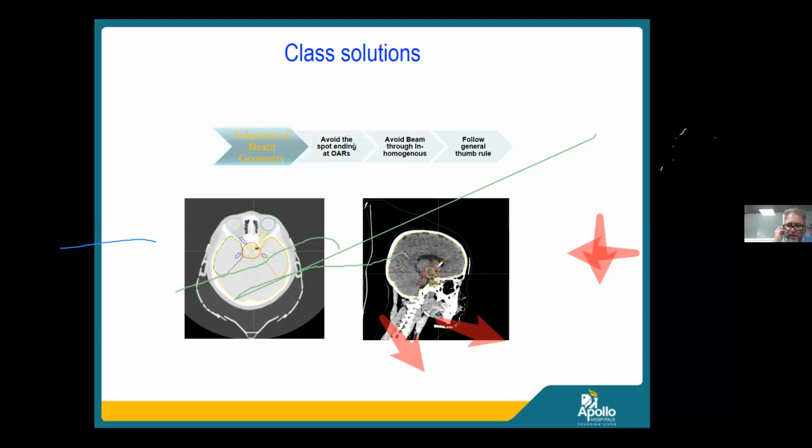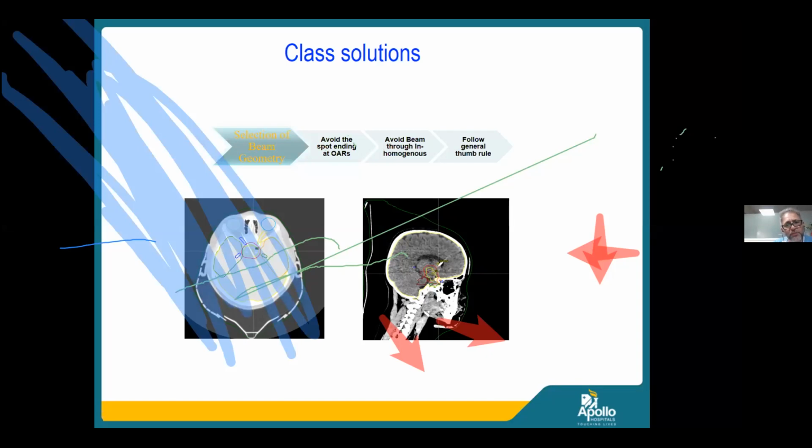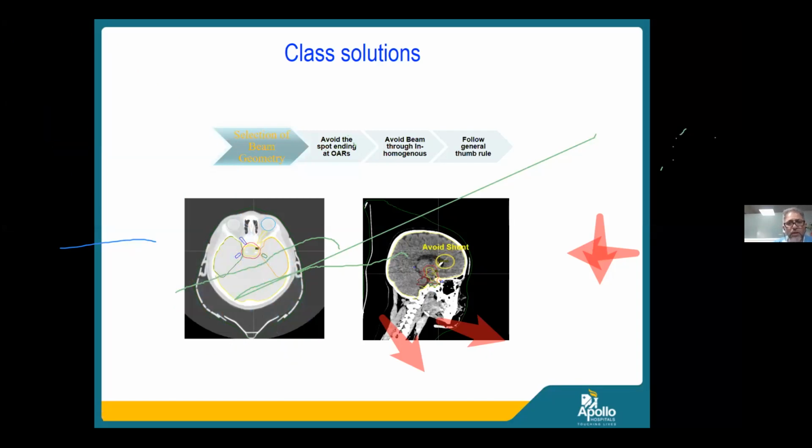These are incorporated in your plan, and it's a very process-oriented plan. So you have to follow the process very religiously with relatively tight thresholds. If you exceed the threshold, you have to redo the whole thing. And that is why proton does take a fair bit of toll. The planning also takes a little bit more time, and you need a lot of hard work and collaboration between your physics teams, the oncology team, and also the treatment delivery team, your radiation therapists. You have to all come into that place.